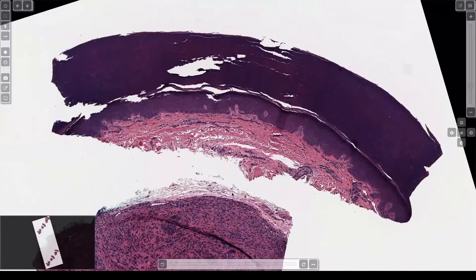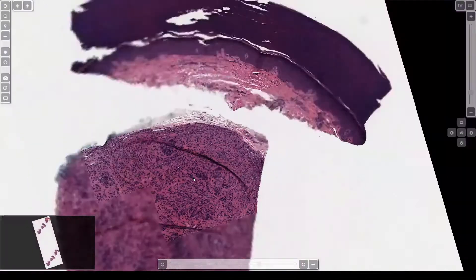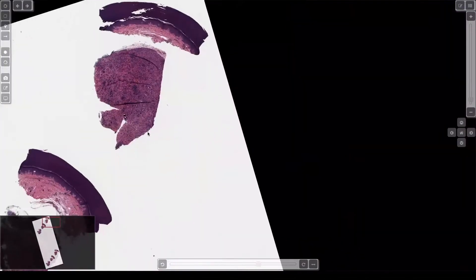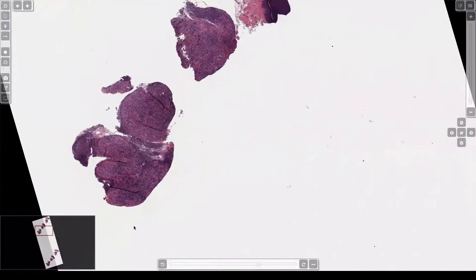We've got a nodule on the acral skin, but it's probably down in the deeper. You can see they've taken off the top of the skin and then popped out this nodule. On acral skin, if you see a nodule like this — a nodule of tumor not taken off by a surgeon from the abdomen, but taken off by a derm — a nodule of tumor with nothing around it, it's almost always centered in the subcutis.